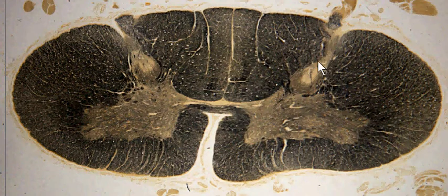With regard to the dorsal horns, note the very light staining substantia gelatinosa. Dorsal to this, we have an important tract called the tract of Lissauer. In the ventral horn, we have a group of nuclei. The most medial nuclei are innervating the trunk muscles, while the most lateral nuclei are innervating the shoulder, the arm, the forearm region, and this area here is probably innervating the hands.